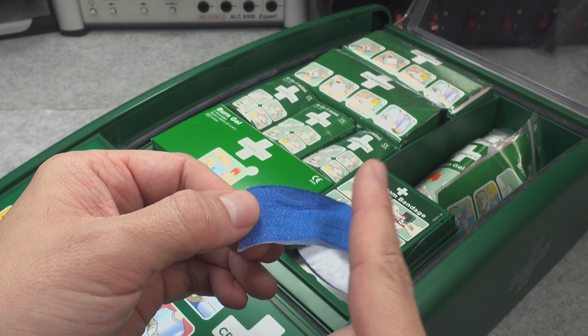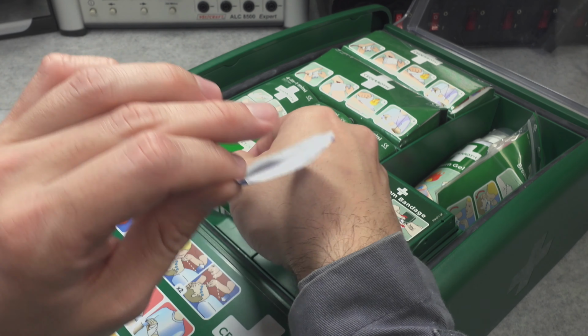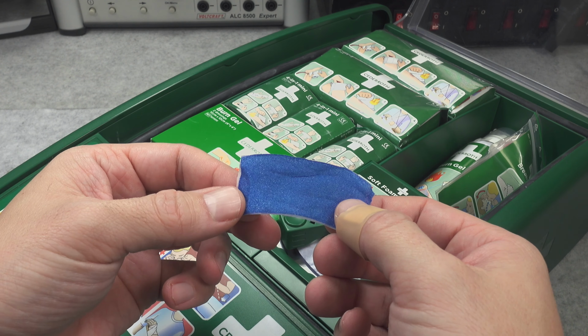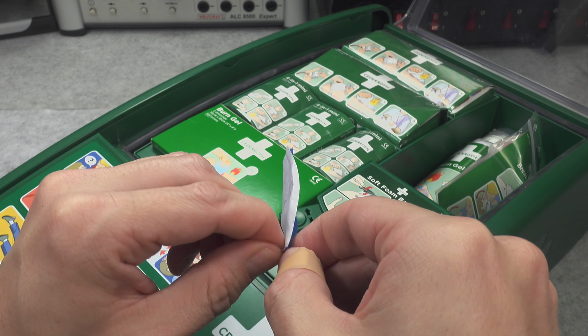And as you can see, I'm touching it with my finger, and it's not adhering. Here I've got a hair, I'm touching it, it does not adhere. But after removing the second side, let me remove it.